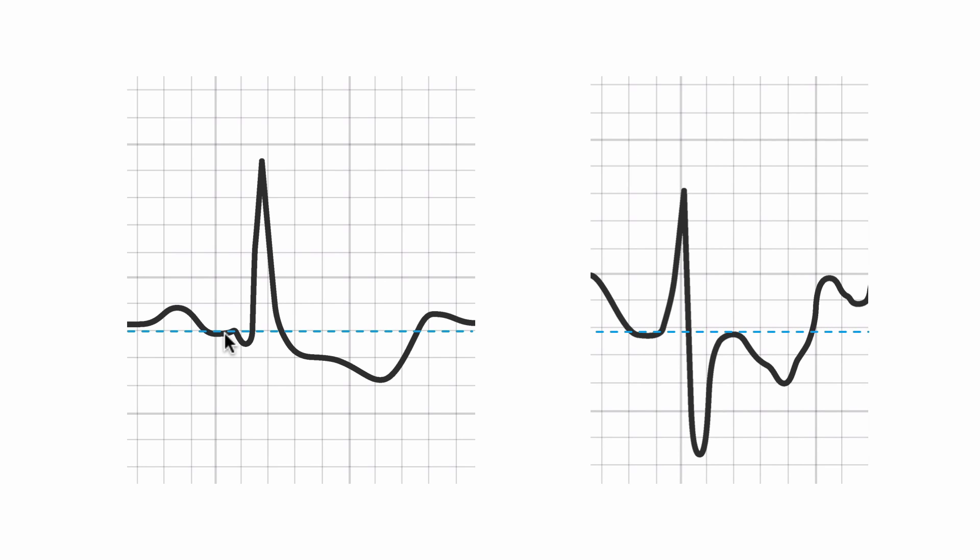Here's our baseline PR segment. If I measure here, I might get a millimeter. If I measure here, I'm close to two millimeters, certainly over a millimeter and a half depression. If we have this down-sloping ST segment depression, we have to have some sort of standard to where we're going to measure the depression.